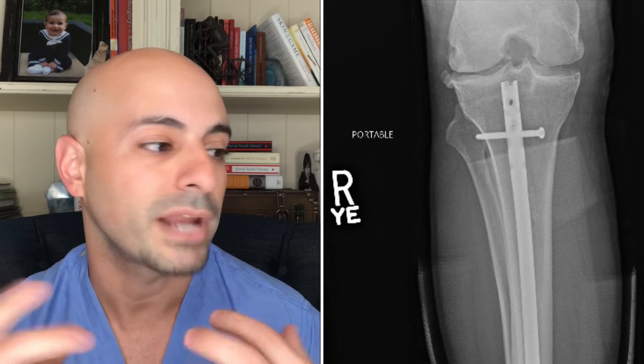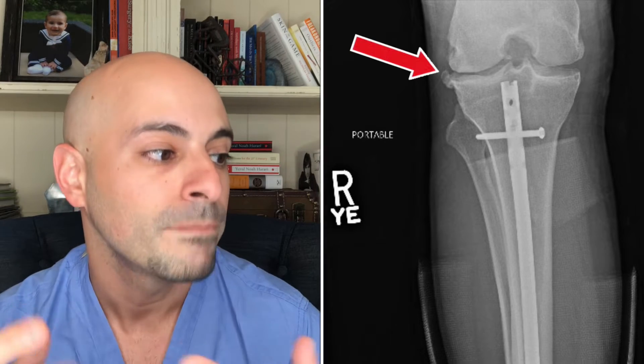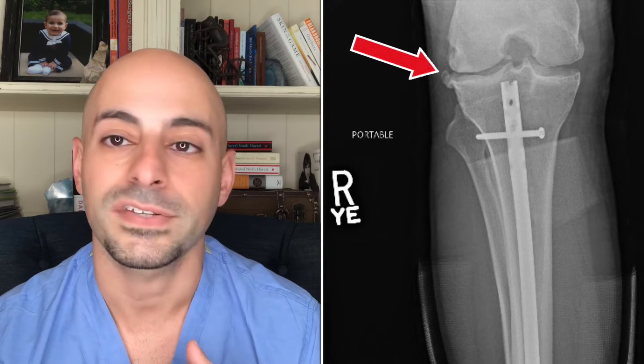Looking at this view, we can also see his knee joint. As a side point, we can see Chris Weidman has some arthritis in his knee. You can see a bone spur, or what we call an osteophyte, on the outside part of the knee — the lateral aspect of the knee — but that's just a side point.